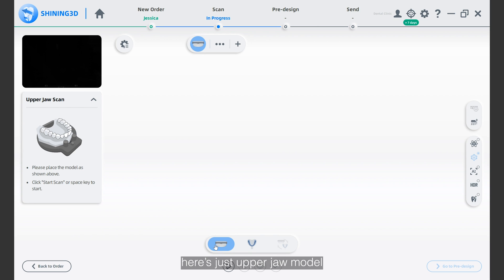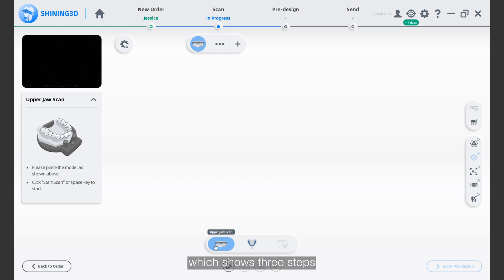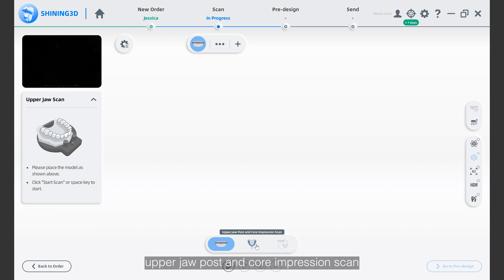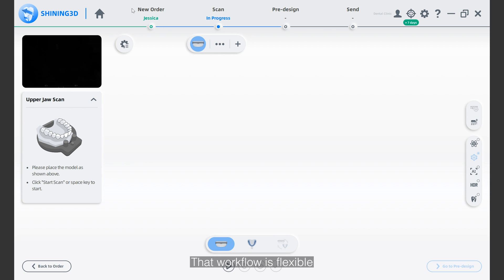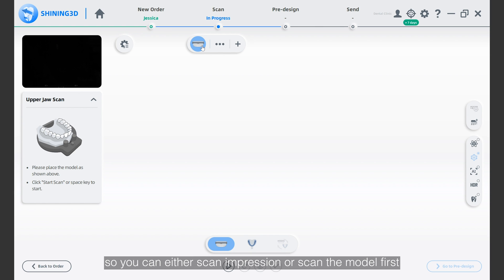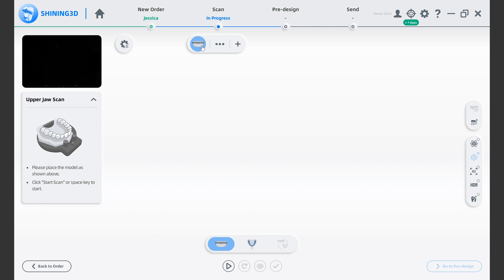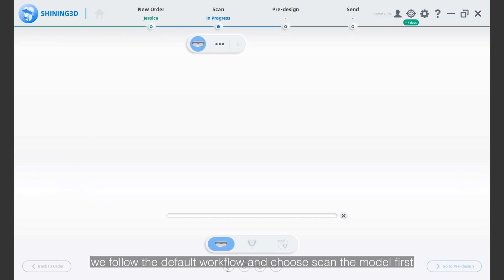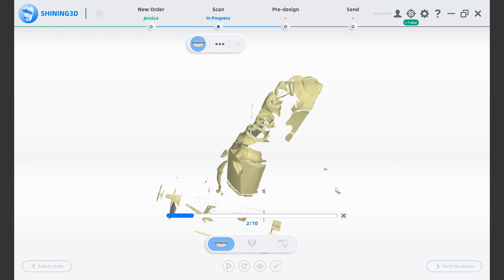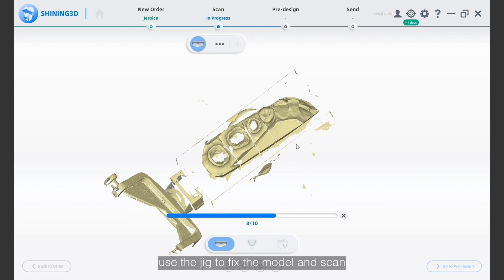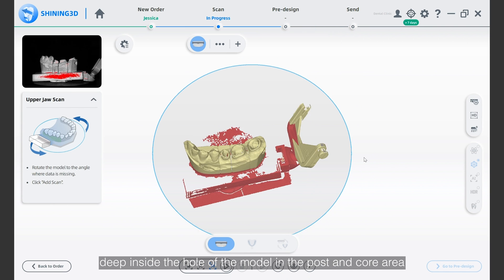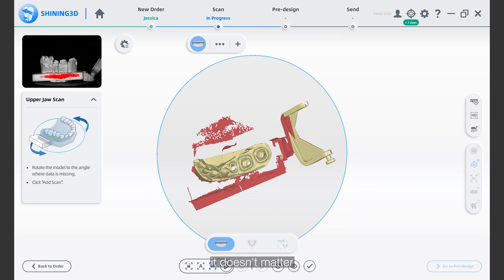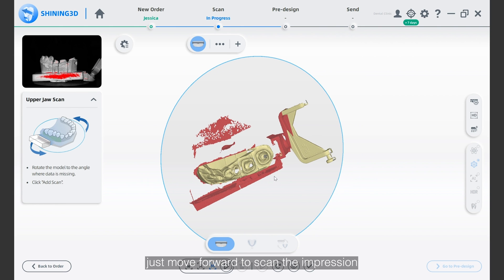You can see here is the upper jaw model. At the bottom, there is a floating bar which shows three steps: upper jaw scan, upper jaw post and core impression scan, and upper jaw post and core impression alignment. The workflow is flexible, so you can either scan the impression or scan the model first. For example, we follow the default workflow and choose to scan the model first. Use the jig to fix the model and scan. It may be difficult to collect data deep inside the hole of the model in the post and core area — it doesn't matter, just move forward to scan the impression.